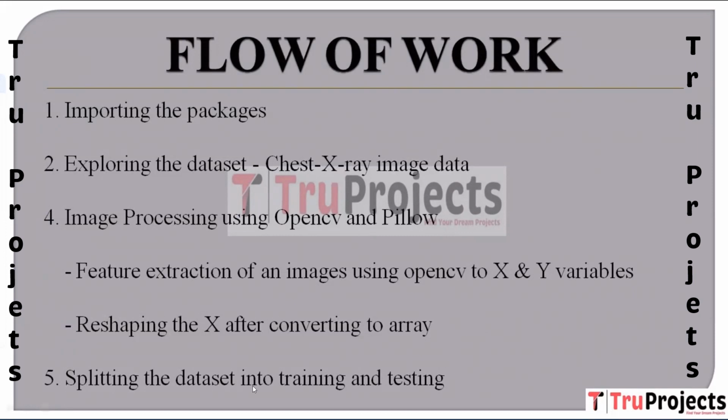Then here next we have splitting the dataset into training and testing. Divide the dataset into 2 parts, one for training the machine learning models and other for testing the trained models. This step ensures an unbiased evaluation of the model's performance.